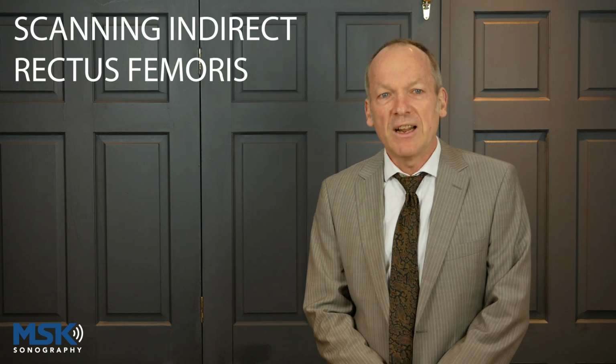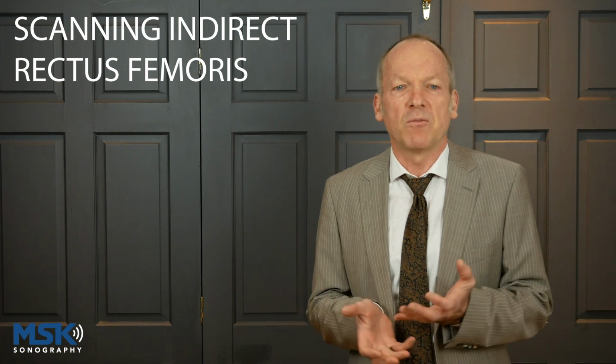Today I'm introducing the Rectus Femoris, the indirect head. Now the indirect head is a recent hot topic in sports medicine, as it's only in the last few years, with our improved ultrasound machines, our improved technology with the great resolution we can get, and our improved understanding of the anatomy of the region and its relevance, that we are starting to incorporate this into our schema of assessment.